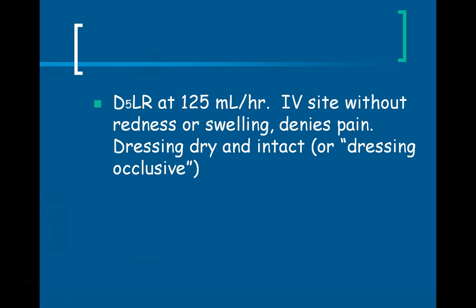And here is an example of what that documentation might look like. So D5-LR at 125 mils an hour, IV site without redness or swelling, denies pain, dressing dry and intact, or you can say dressing occlusive.